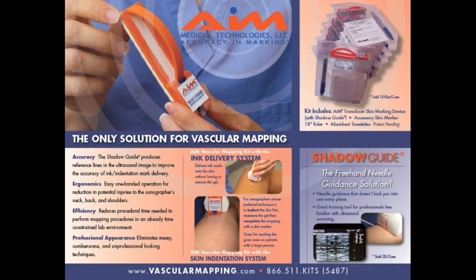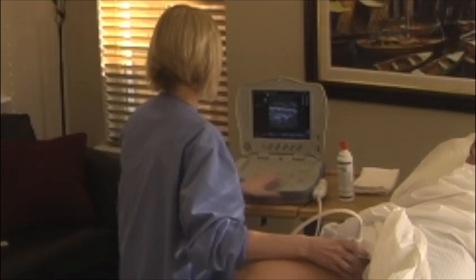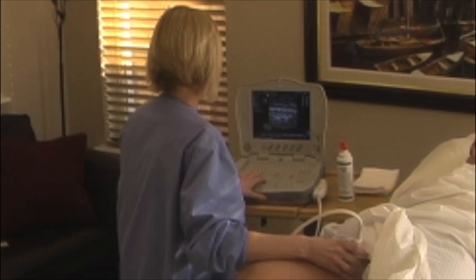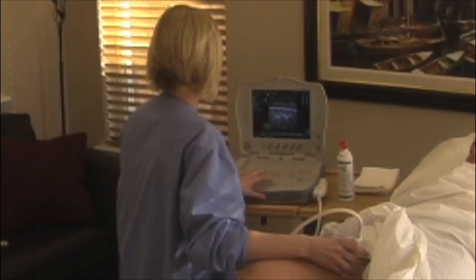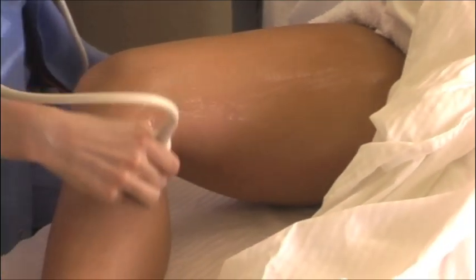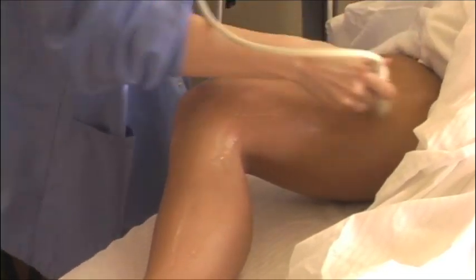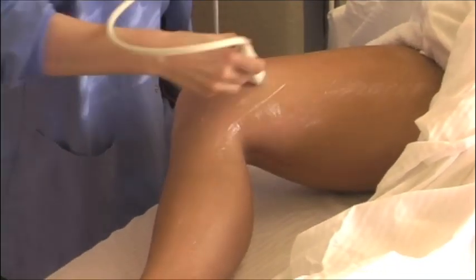This video presentation contains a demonstration of the AIM Vascular Mapping Kit with the ink delivery system. It is recommended that you perform your evaluation and measurements of the anatomy prior to applying the AIM device to your transducer. Upon completing your evaluation of the target anatomy, ensure that a generous layer of coupling gel remains on the skin to aid in the delivery of the ink marks.